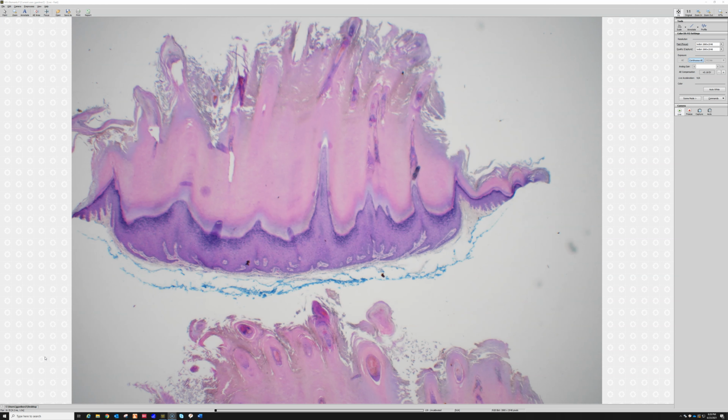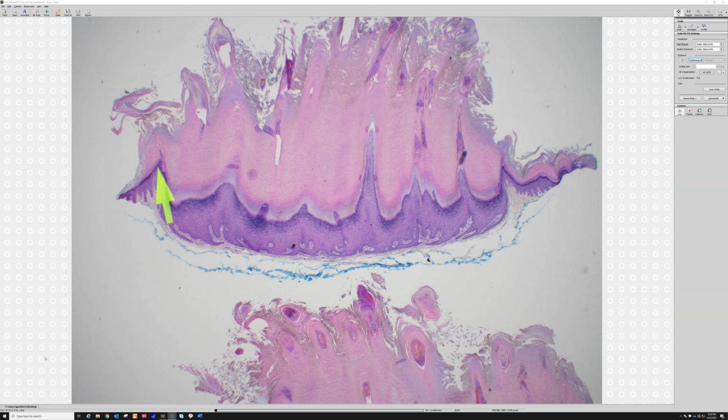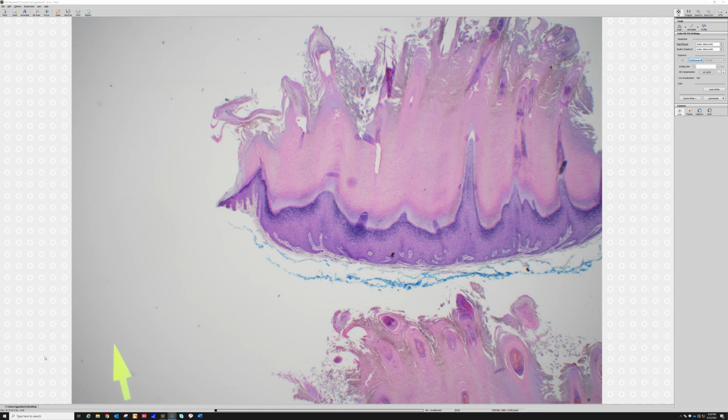And look, that in-toeing is so dramatic. Like all the toes are kind of fusing together almost to become like one. They're all so curved in. And this one is not nearly as acanthotic as the last couple I showed you, okay? There is acanthosis though. See, here's the normal epidermis here. And then look how much thicker, if you go from the granular layer down to the basal layer, the epidermis here is much thicker.